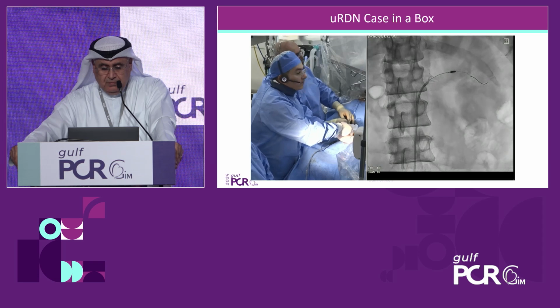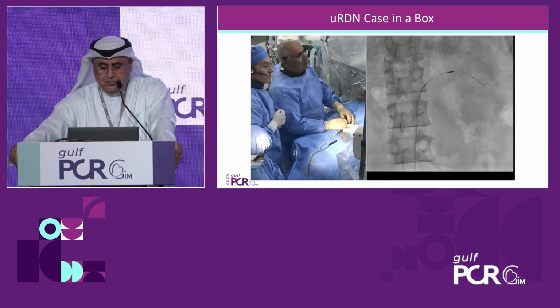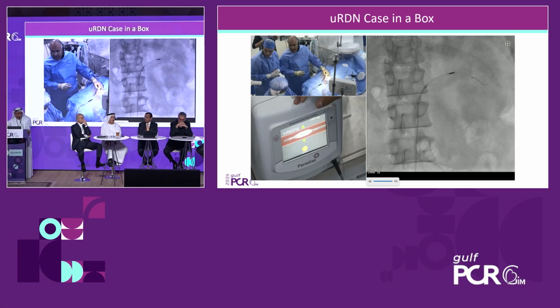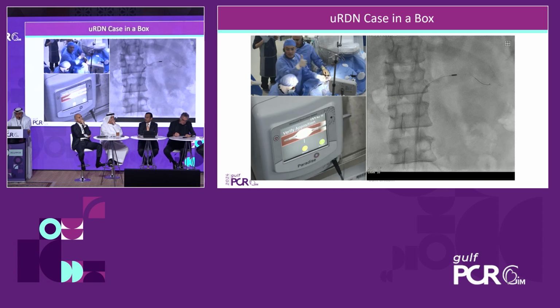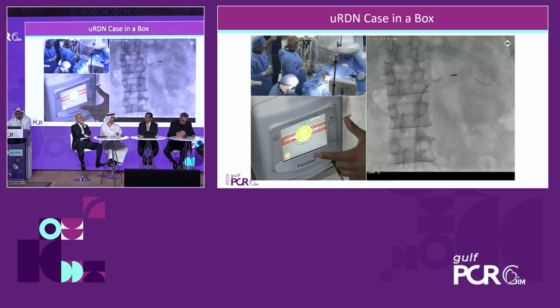We are at the curve. Can go a little back if we wish to, but I think we are fine. Here, can we inflate, please? We are more than 1 centimeter. See, it's inflated. So Test, please. So now we are blocking nicely. Safe. So, safe. Can we start? So we'll have to inject.